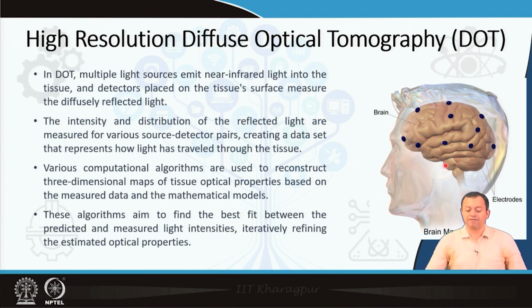So, yes, near infrared spectroscopy deals mostly with hemoglobin, oxygenated or non-oxygenated blood, but you can also tag and thereby make other fluorophores absorb a particular light which otherwise is non-absorbable by the brain, but then you are also trying to look into the output, a wavelength which may or may not also be absorbed by the brain.